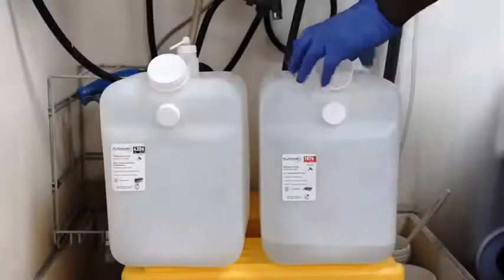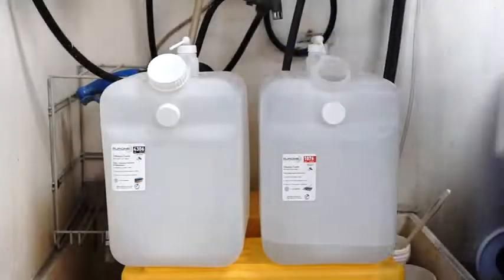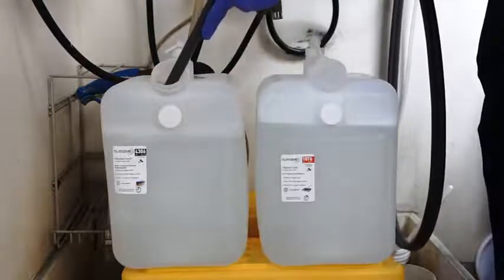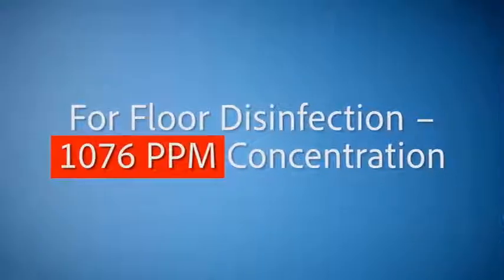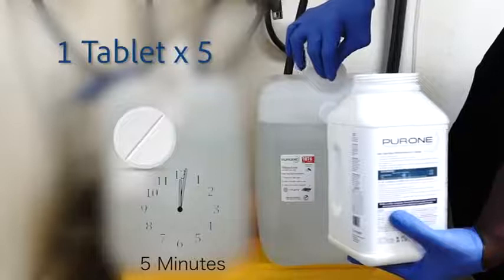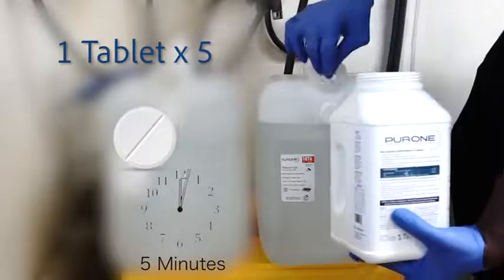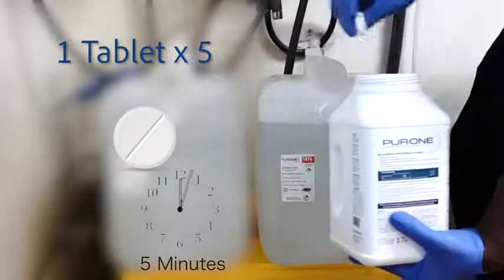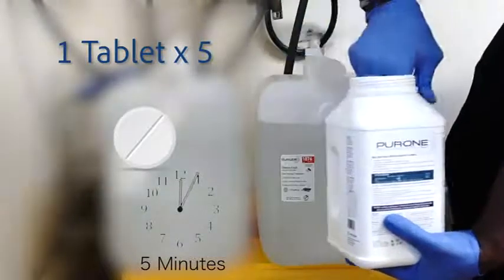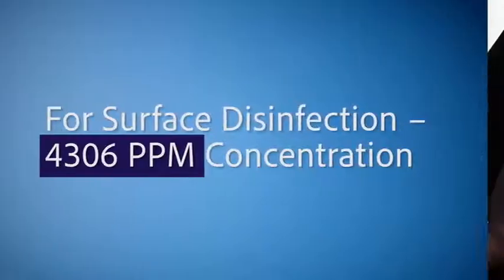Place the 5-gallon containers in a vertical position. Fill the 5-gallon containers to the fill line with warm tap water. Select 5 13.1 gram tablets of Pure One and drop them into the tank one by one. Wait at least 5 minutes until the tablets have fully dissolved before replacing and closing the cap.